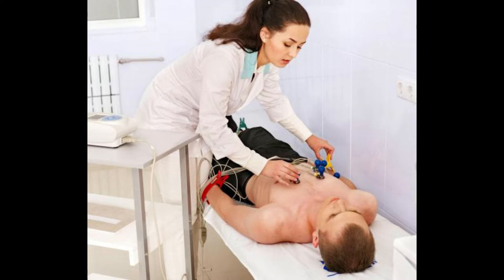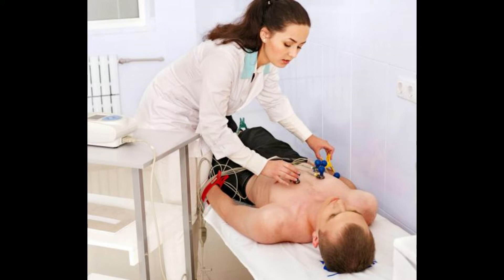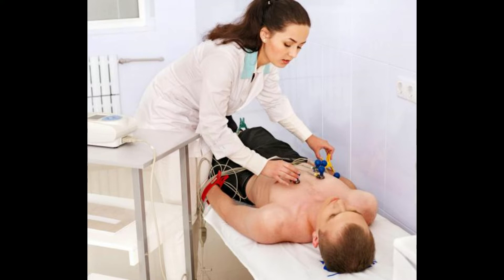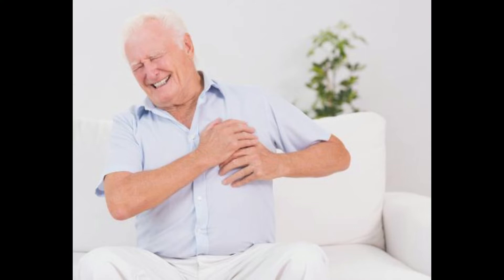Healthcare professionals use ECGs to map and graph cardiac activity for a wide variety of patients, some with heart diseases and conditions and others who are otherwise healthy. The scans can give a good sense of the heart's strength generally and can also identify small problems with things like heart rhythm that could get worse over time. Most graphs are divided into left and right axis, and abnormalities on the left side are often referred to generally as left-axis deviation.